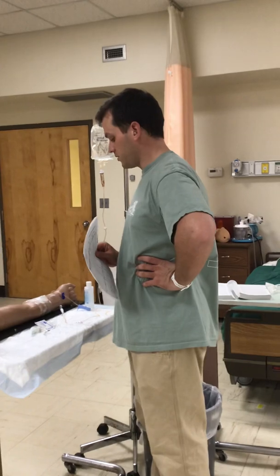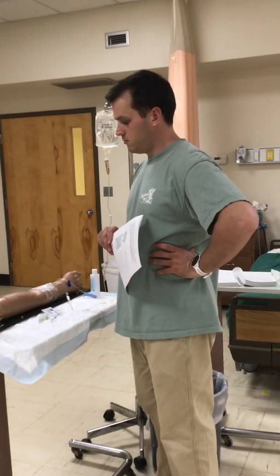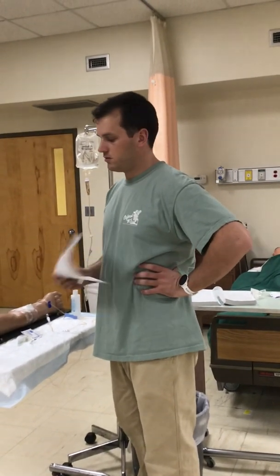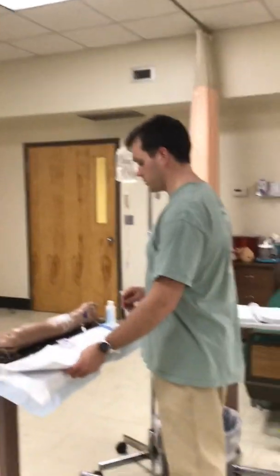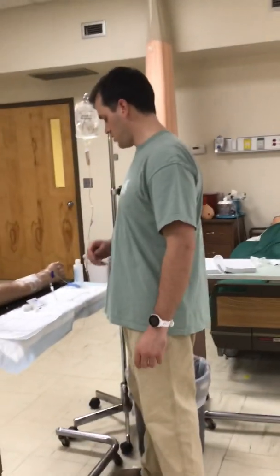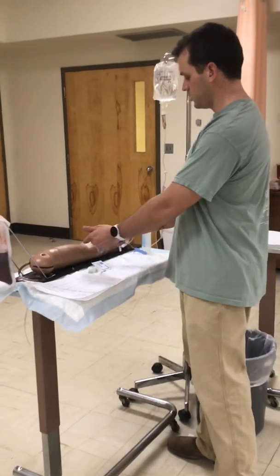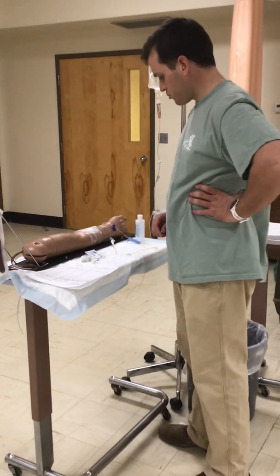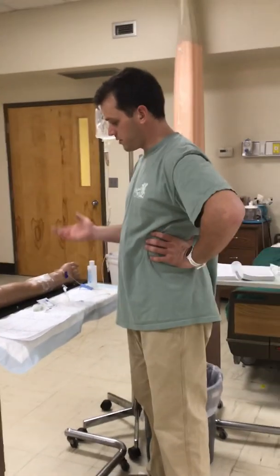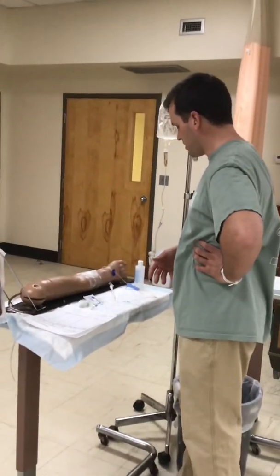I'm going to tell her that I'm giving her furosemide to hopefully get rid of some of the fluid that she has. So let her know that she might be urinating a lot or urinating frequently. I will be administering this medication via the hub closest to the IV site. And I'm also going to tell her that I'm not going to have to stick her again or anything like that. I'm going to be using the primary line.